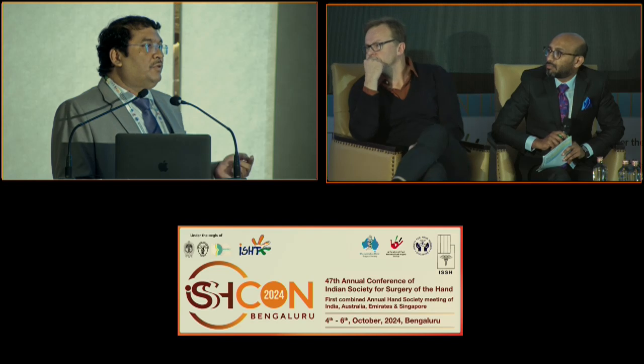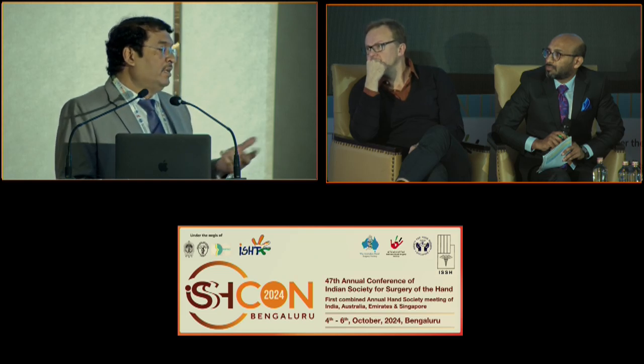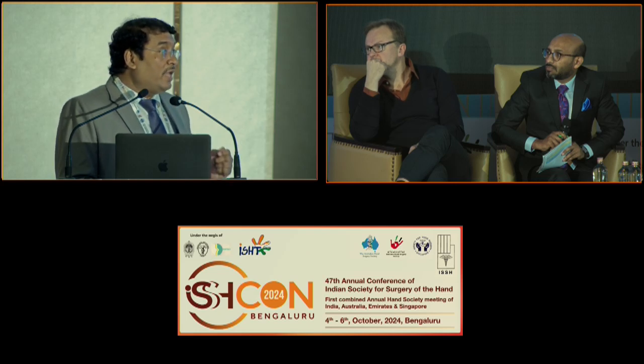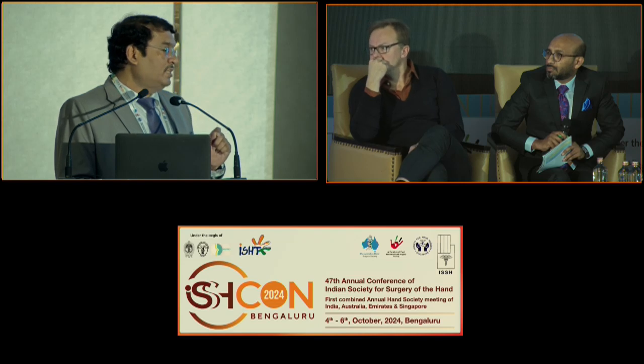Correct. So if that is the case, then we can. They are using a thin wire loop nowadays, which is very useful rather than retrieving these threads, especially fibrous ones. Yes, of course, it's very difficult. The wire loops are thin, and they are devoid of any knots. We are not putting any intra-articular knots in the midcarpal joint. That will be very useful.